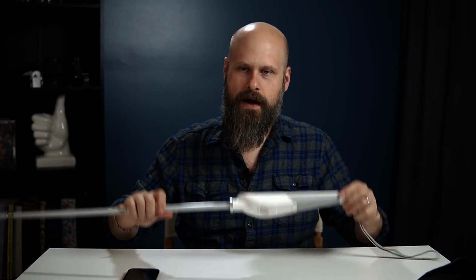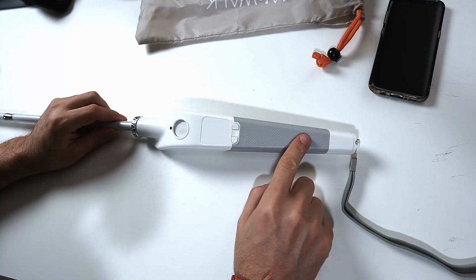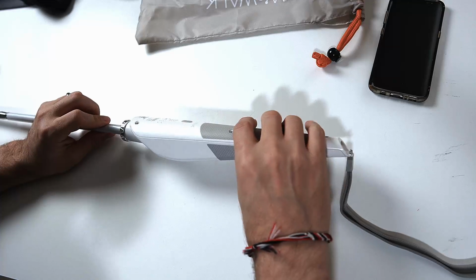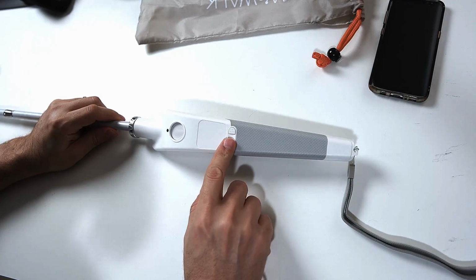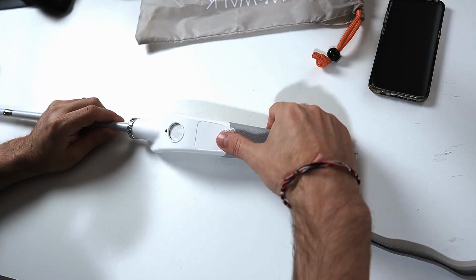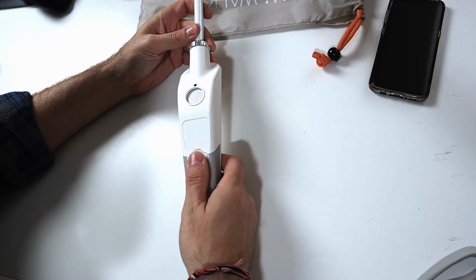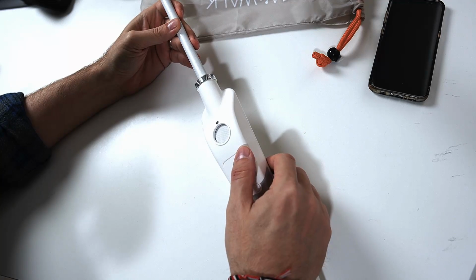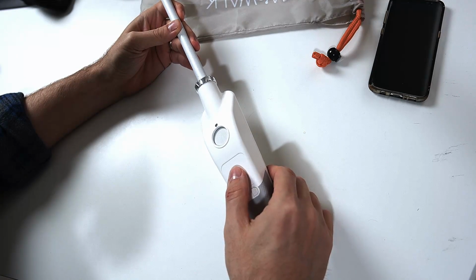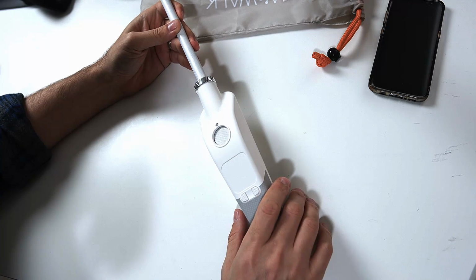So let's take a quick tour of the WeWalk device. On the front here, we have the non-slip grip. This actually wraps completely around the handle. Just ahead of that, you've got these two bumps here, and this is actually where you rest your thumb. So when you're holding the cane, the thumb rests in between these two bumps. Right above that is a large square, and this is the touchpad. This is how you control the different operations of the cane.